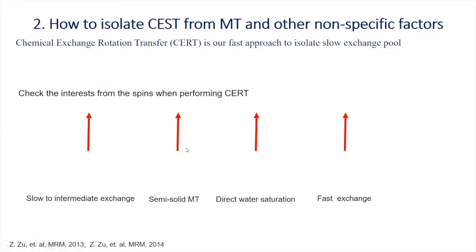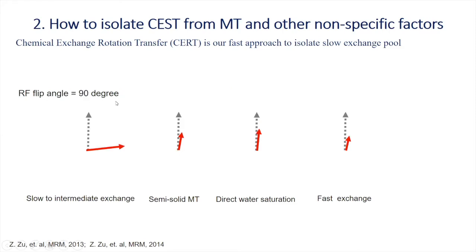Now let's perform a pulse sequence with 90 degree. We can find that only this spin rotates to nearly 90 degrees, while the other spins only shrink to a level. When we perform the pulse sequence with 180 flip angle, but keep the same average power as with flip angle 90, we find that only this spin rotates, but the others are kept constant.